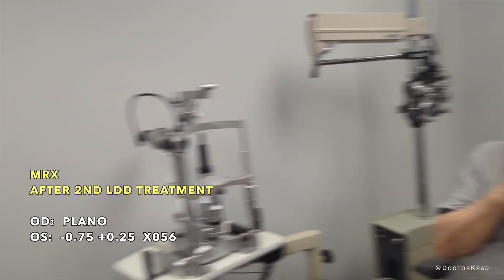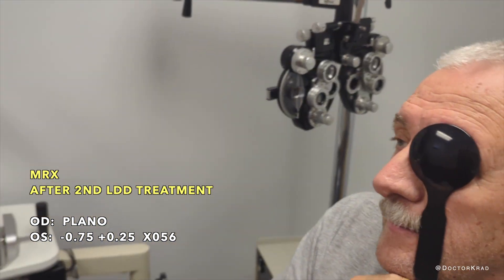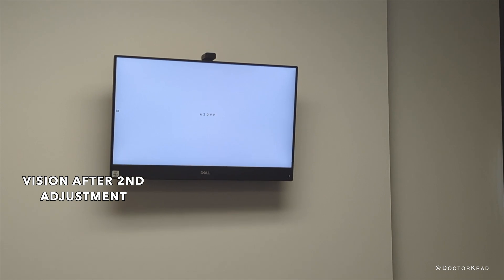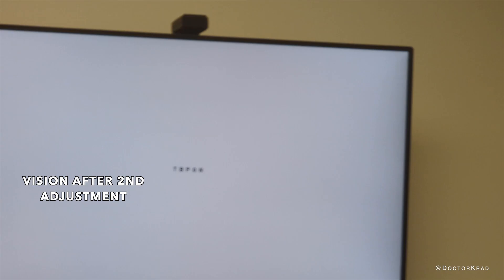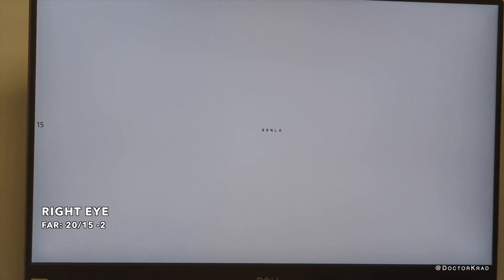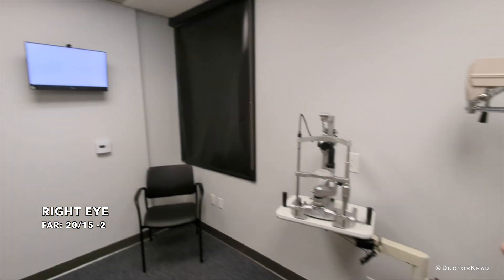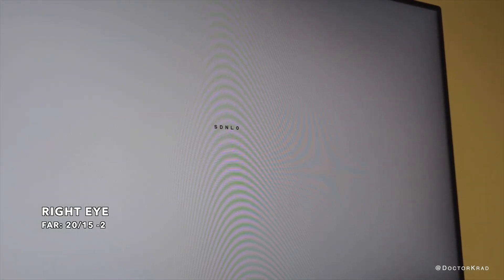First, cover your left eye, and then we're going to have you read some letters here. Can you read these letters for me? Can you read this? How about this? Can you read that? How about this very small one here? I see the before-last is L. So just to give you an idea how small this is — that's very good.